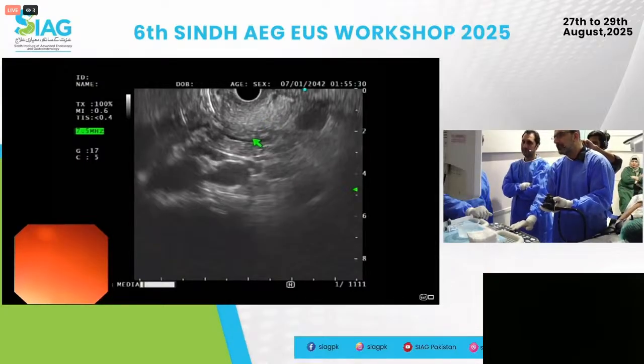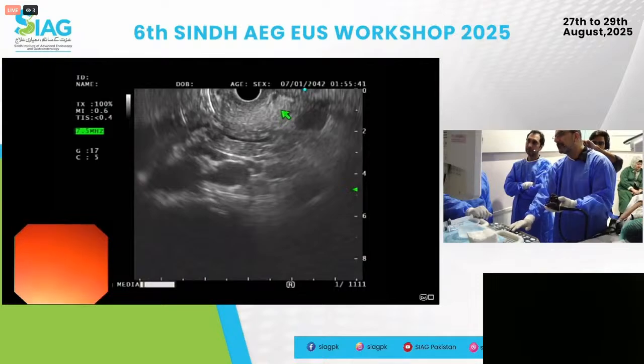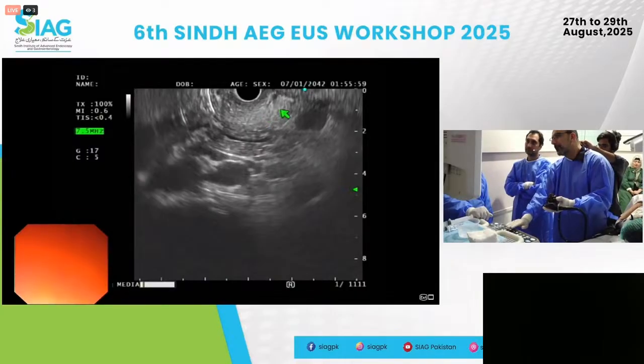So in non-divisum conventional anatomy, you will follow the pancreatic duct crossover from ventral dark to dorsal bright, and you will see the PD go up and around the portal vein like this. In the setting of divisum, this will stop about here somewhere, even shorter. And instead you will see the duct here going into the minor, and it'll always be in that bright dorsal pancreas and go up this way.